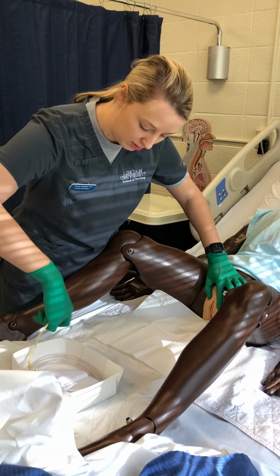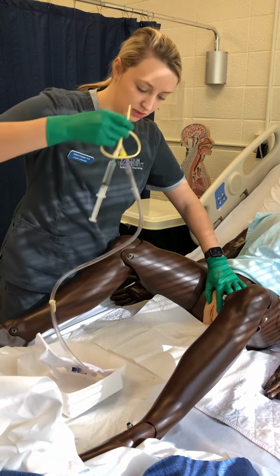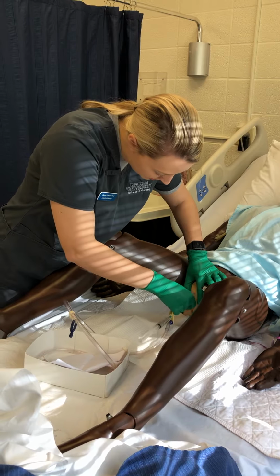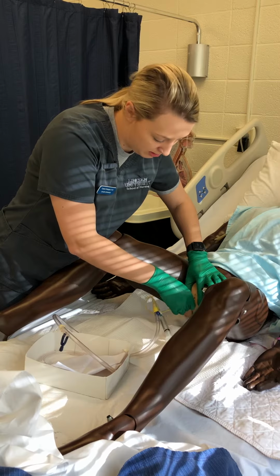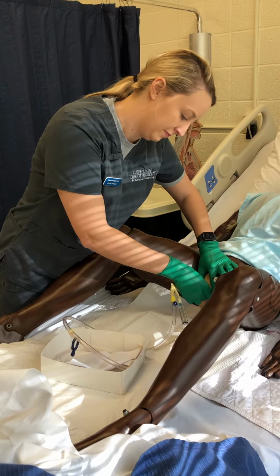I'm about to insert the catheter, so you might want to take a nice deep breath. I'll tell you as I'm about to insert it. So, take a deep breath. 1, 2, 3. And I would insert it until I see urine come back. And once I see urine come back, I'll push it in another 2 to 3 inches.